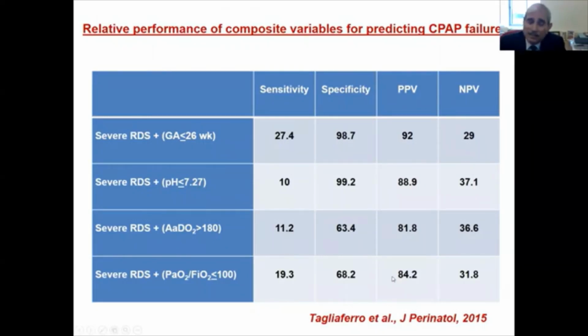I think it is, that's why I think CPAP, particularly bubble nasal CPAP, it's not just science, it is an art. So it's a combination of science and art, and unfortunately, we cannot do a comparative trial at Columbia to show that it's superior, but I'm sure someone at some stage will be able to. So I don't think we are there.